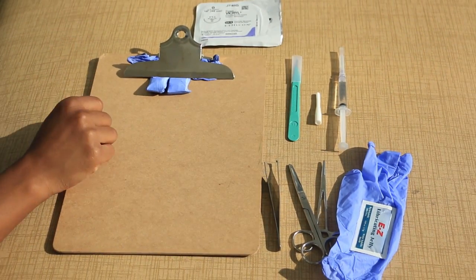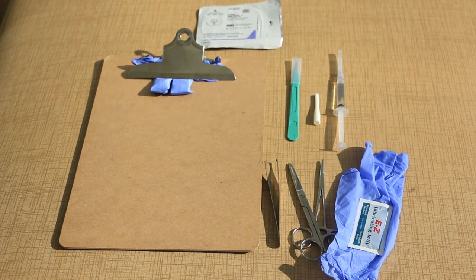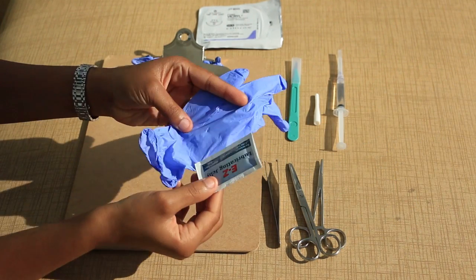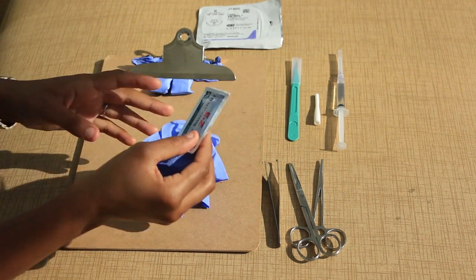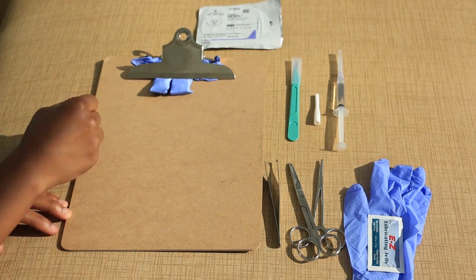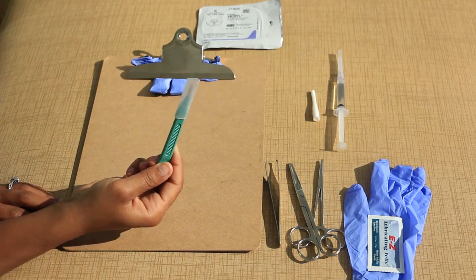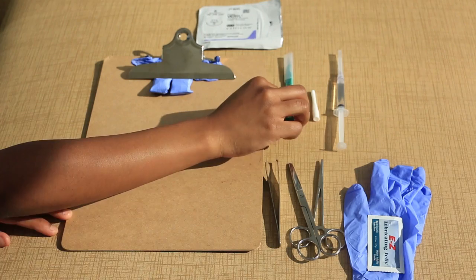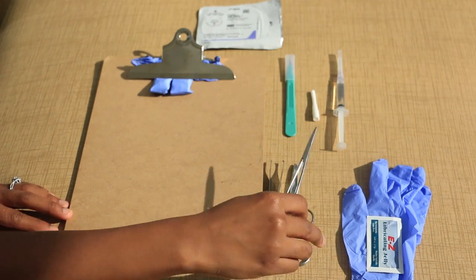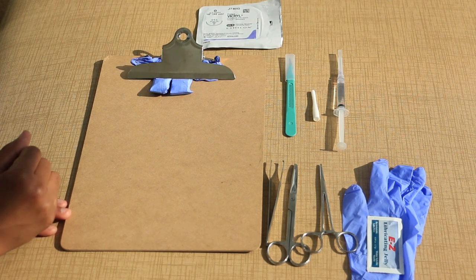To recreate this simulation, you will need the following, all of which are commonly found in labor and delivery: a latex glove, a packet of lubricant, and also a word catheter kit, which includes one word catheter, a scalpel, and typically a set of hemostats or Kelly clamps. A clipboard is optional, but it can help stabilize the simulation if you are doing this alone.